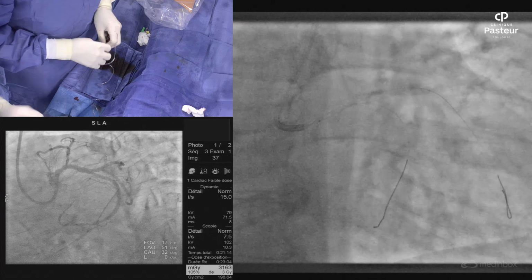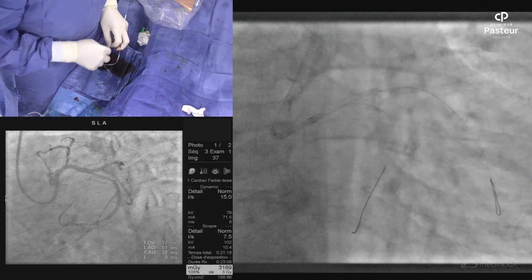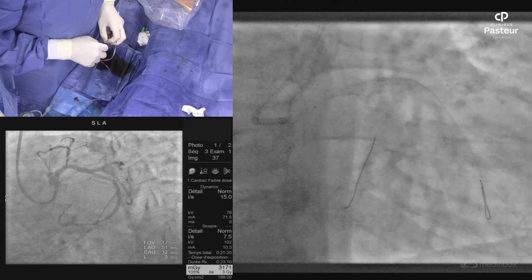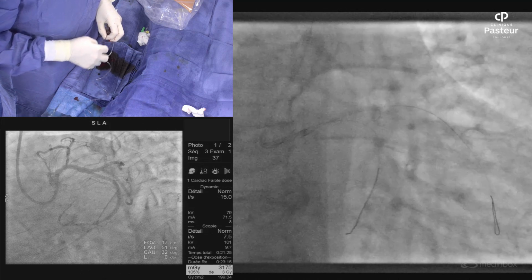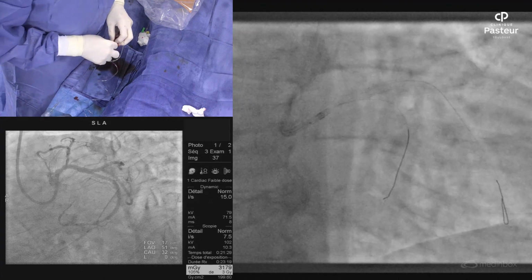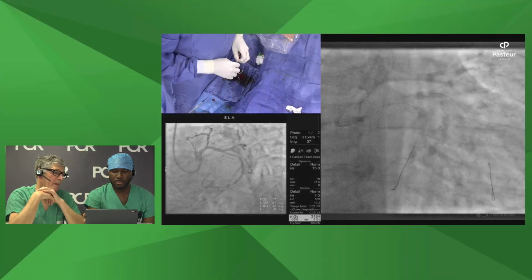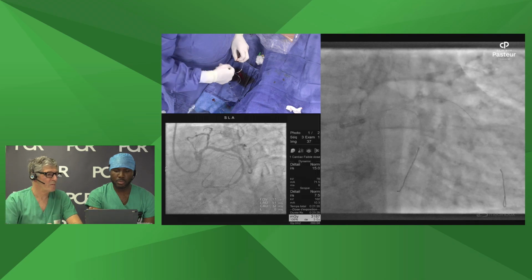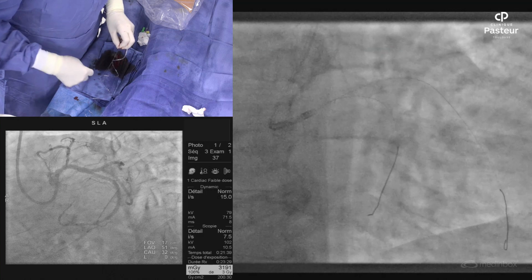This is interesting. It's negative. It's a non-compliant balloon. This is one of the limitations of non-compliant NC balloons. Sometimes, maybe if I cannot, I don't want to be too aggressive. We will take a 4.0 or 4.5, but semi-compliant. It's important not to force. Okay, give me a 4.5. So interesting.